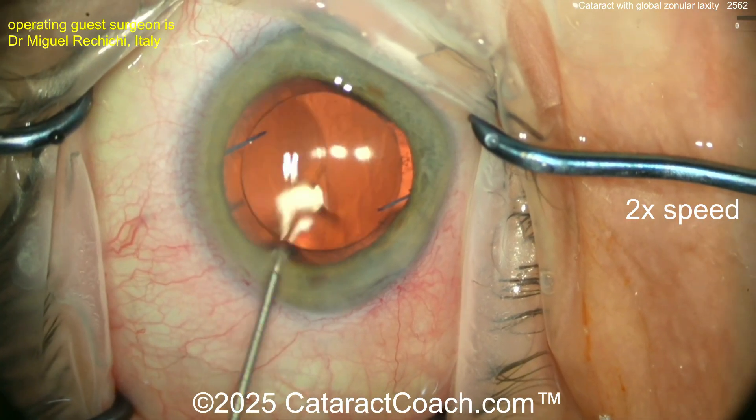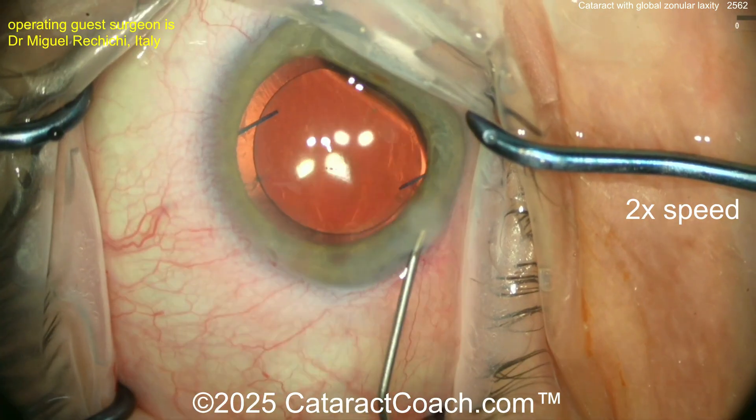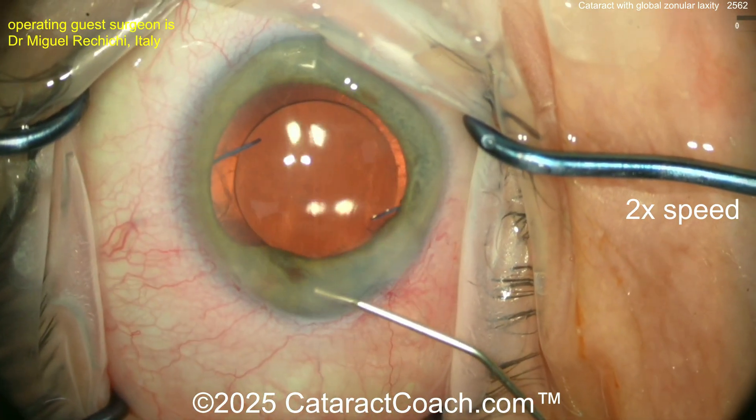At the end, seal up the incisions. Also make sure there's no prolapse of any vitreous. Maybe a pinch of triamcinolone would be helpful. Hydration of the incisions — great job, interesting case.